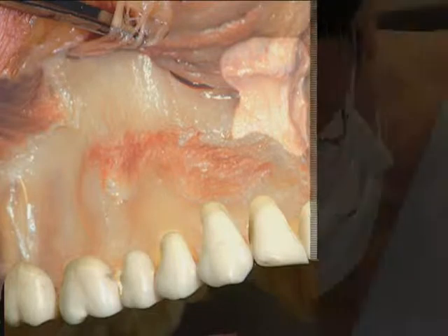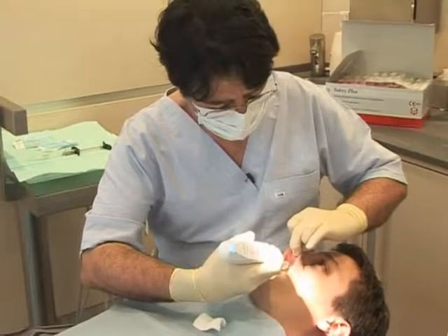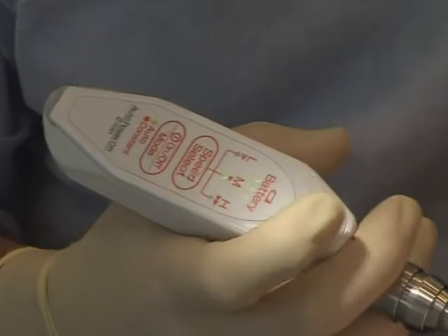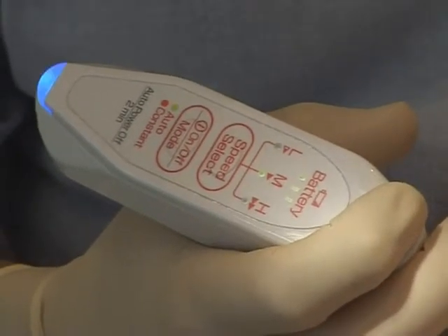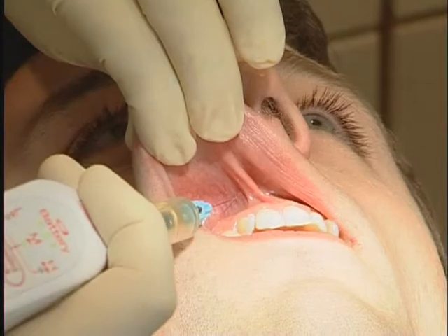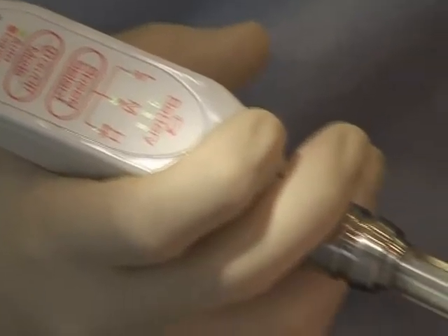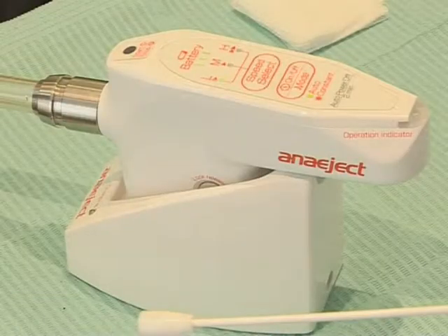As an injection into this fiber bundle is very painful, the injection point is usually targeted towards the apex of the lateral incisor. We use an anaject syringe for this anesthesia procedure as it gives precise control of the injection speed, a big advantage in this very sensitive area. Detailed information on the preparation and use of this type of syringe are given in a specific section on this DVD.